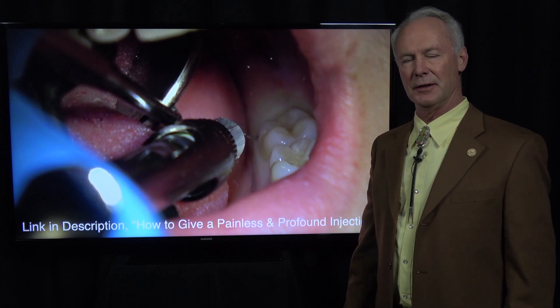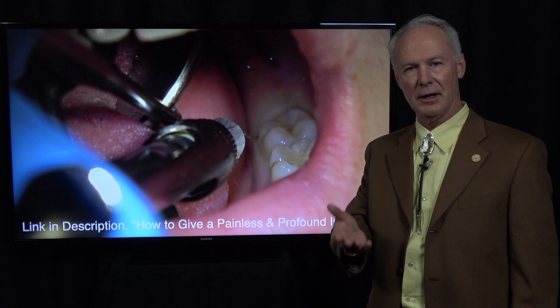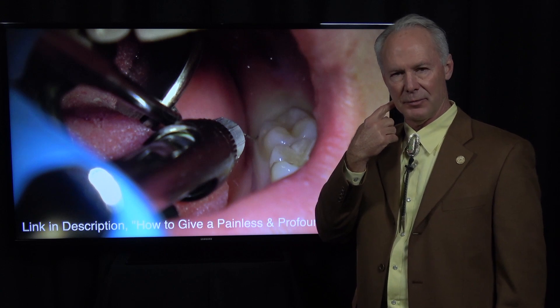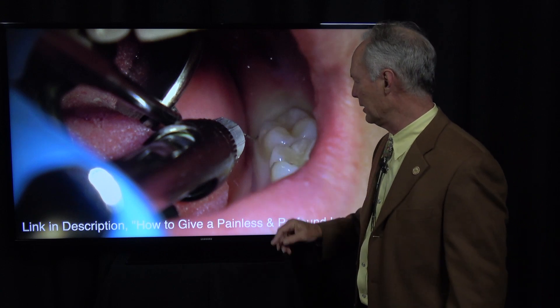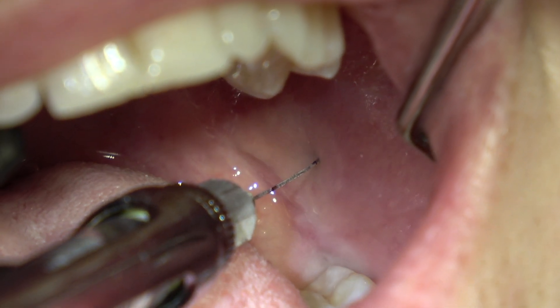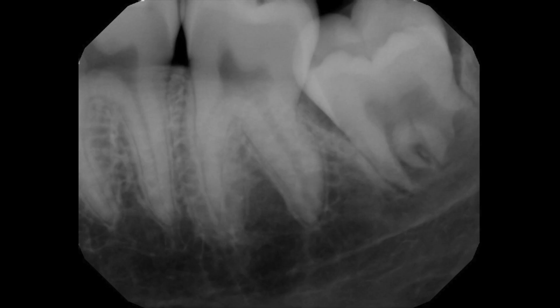Many times I'll see new patients and they'll say their biggest fear of dentistry is not being completely anesthetized because they've had a bad experience with a dentist who didn't get the tooth completely numb. What I know is that dentist was not giving an intraligamental injection after the infiltration or the inferior alveolar nerve block. So give that intraligamental injection if you want the tooth to be completely dead numb. You'll see I was just injecting into this space and it will numb everything.